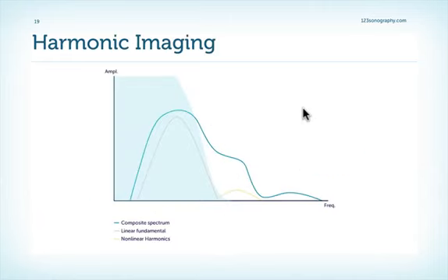The neat thing about ultrasound is that we can decide which component of the return signal we're going to use for further processing. Either we use the component which has the same frequency as the send frequency, then we call it fundamental imaging, or we can filter that out and only use the harmonic component, then we call it harmonic imaging. But why would someone want to use only the harmonic component, which obviously has a much lower amplitude? The reason is quite clear. The image quality is better. We have much less artifacts.